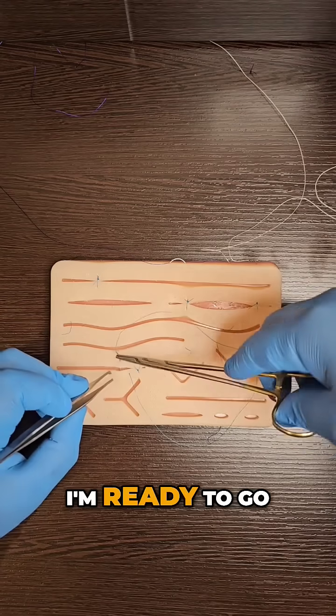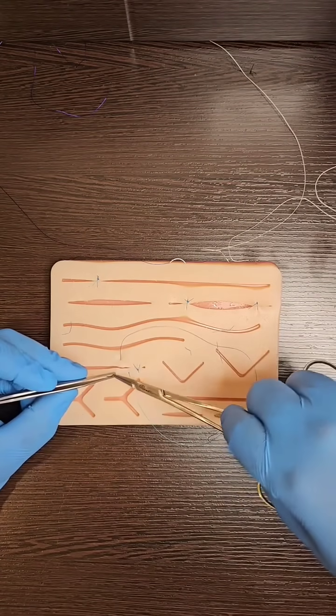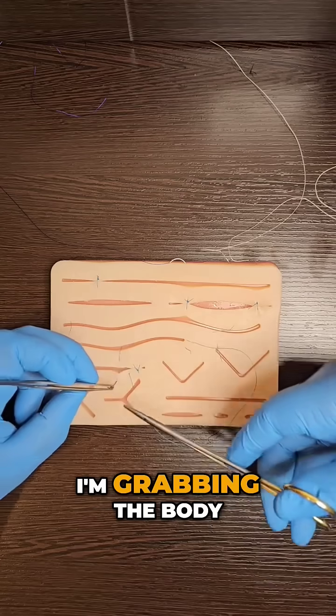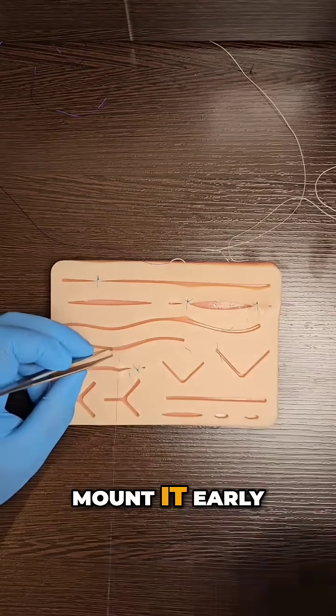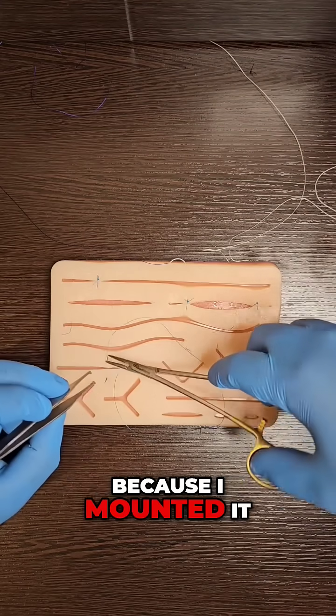I'm ready to go. Push it through. I'm not grabbing the point, I'm grabbing the body. Mount it early, pull it through. I do not need to readjust the needle because I mounted it exactly where I wanted it.